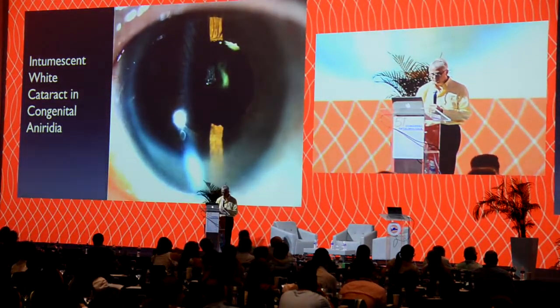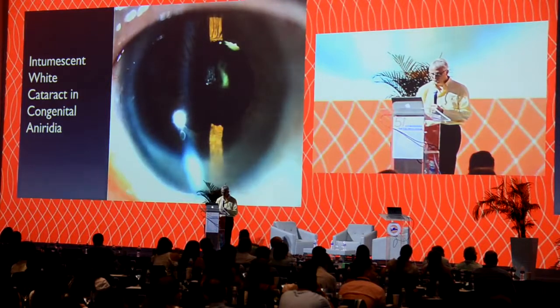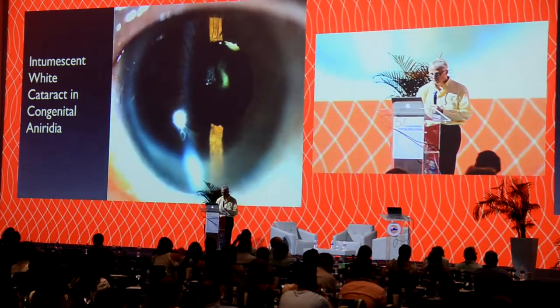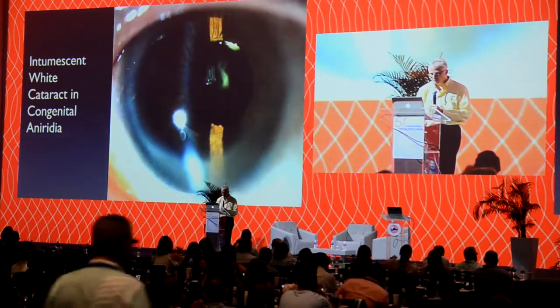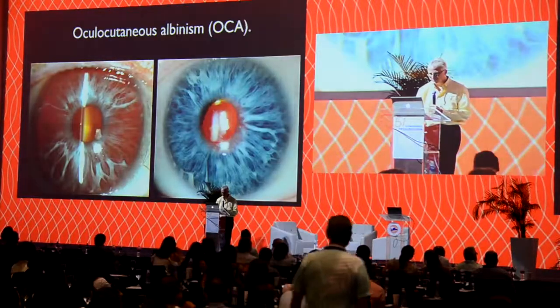Looks pretty darn good. We've actually had some of these patients where the patients have gone to an urgent care and they've said they wanted to dilate the pupil. Said, no, you can't do that. It's plastic. No, let's try anyway. Right? They didn't believe them.